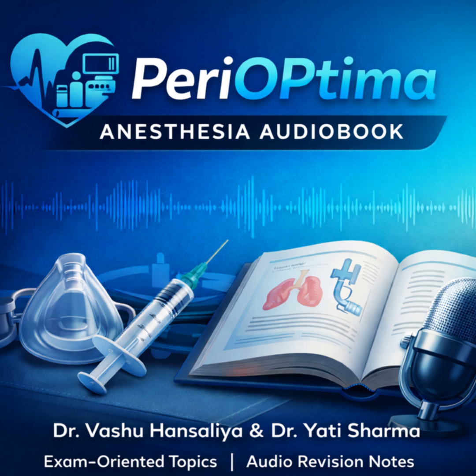In that case, you treat the MAP, not the systolic pressure. Section 17, the comparison. IABP versus ECMO. The examiner asks you to compare them side by side. Let's create a mental table for the listener. Okay, let's do it. First, mechanism. IABP is counterpulsation. It's an augmentation device. ECMO is bypass. It's a replacement device.